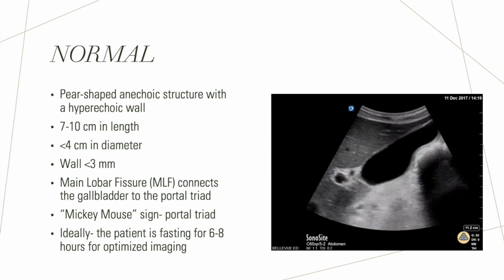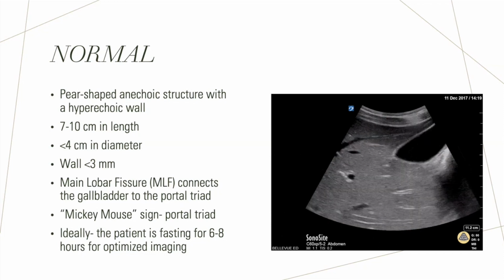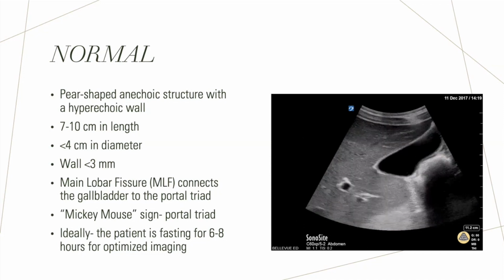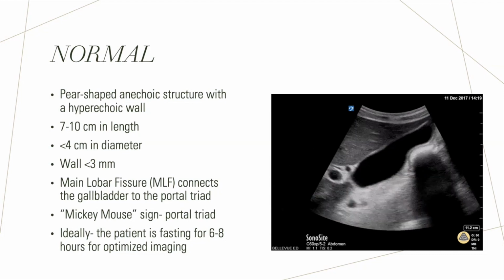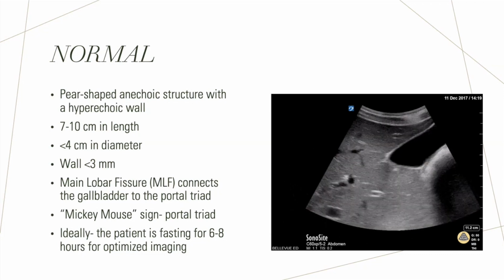And then ideally, for best image quality, you want the patient fasting for at least 6 to 8 hours prior to imaging. This is because you may have the gallbladder contracted and you might not have a great image when viewing shortly after eating.